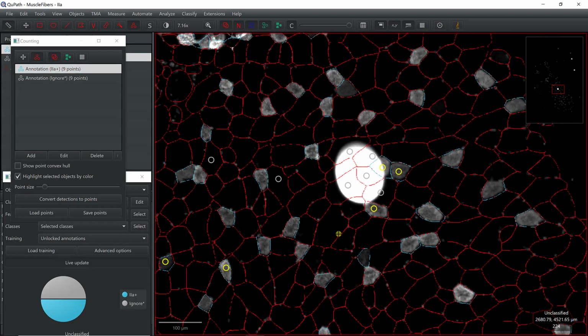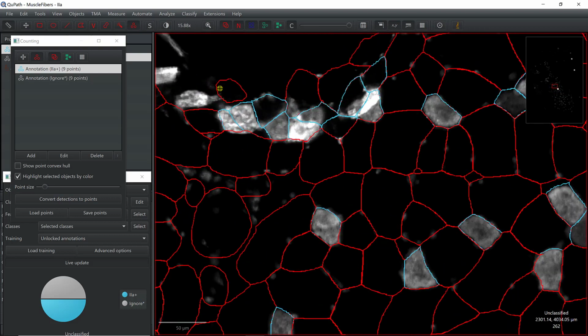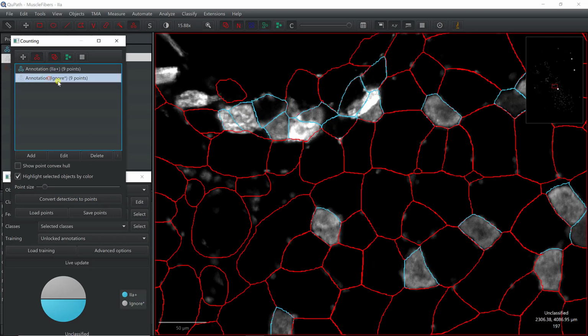And so now I have 9 positive examples, 9 negative examples. This is definitely a negative example, so I'm going to say, okay, this is not positive. Here, this is tricky, but I can try. Okay, so I'm going to say this is positive. Let's say this is negative.